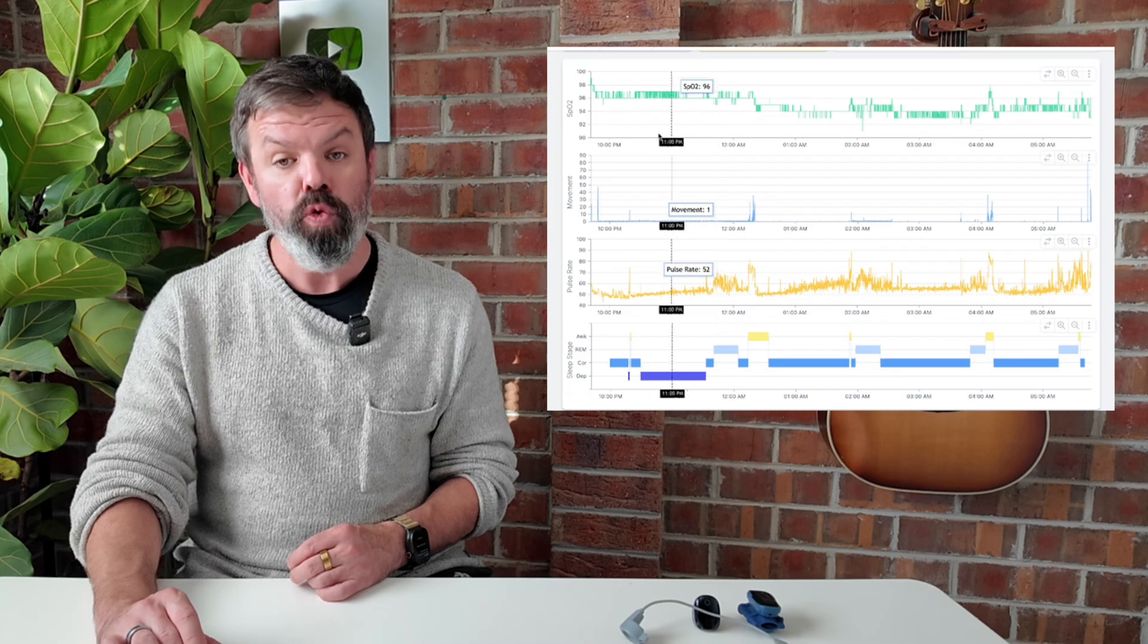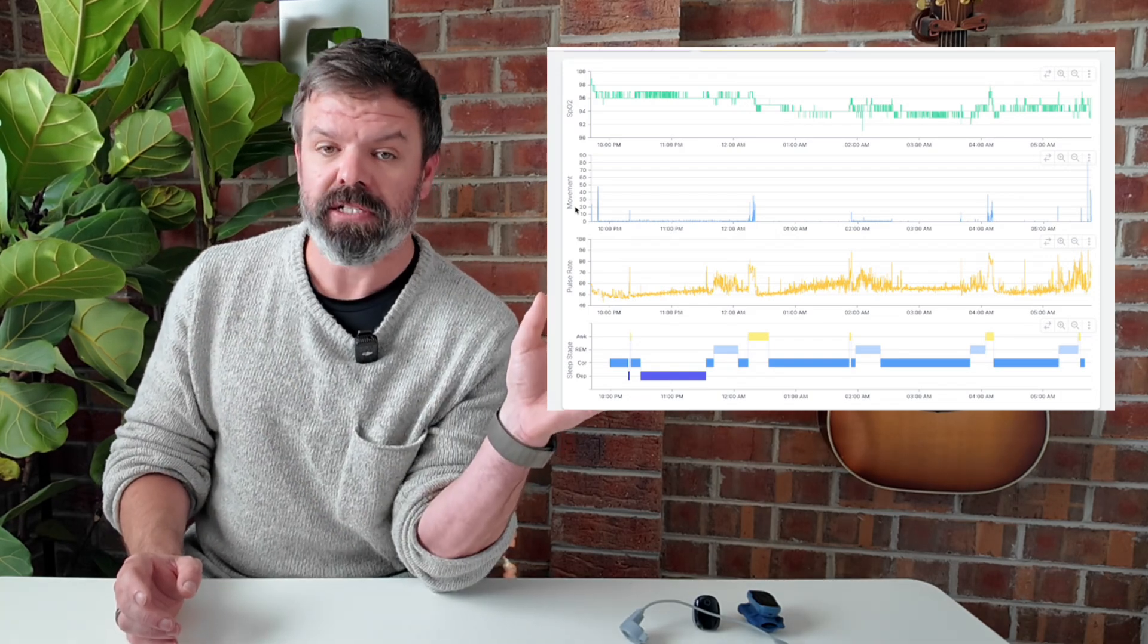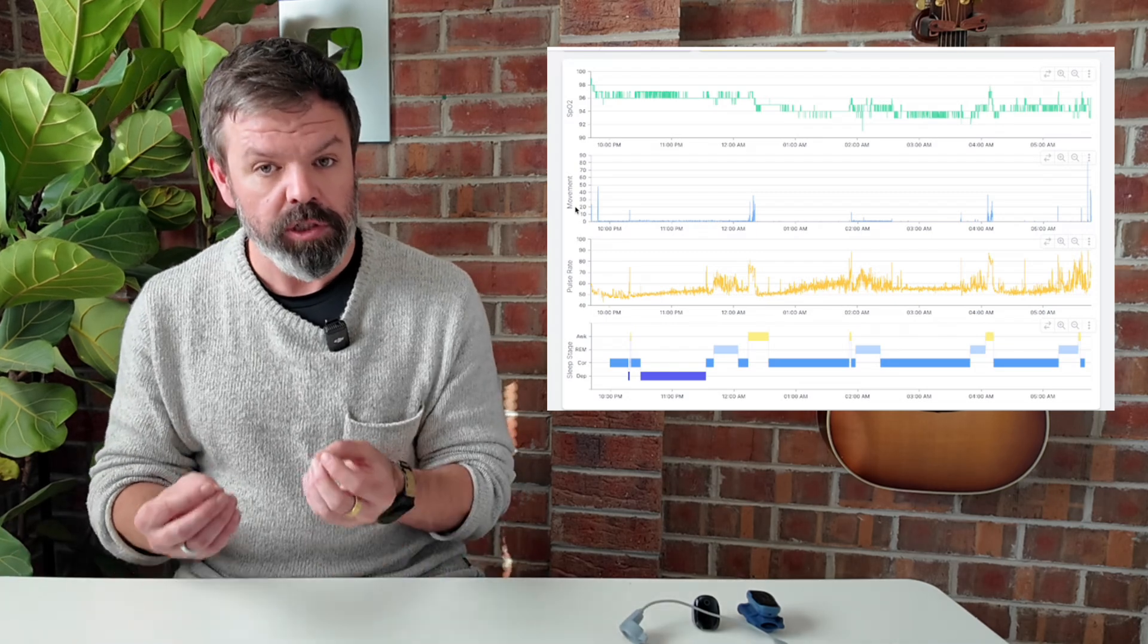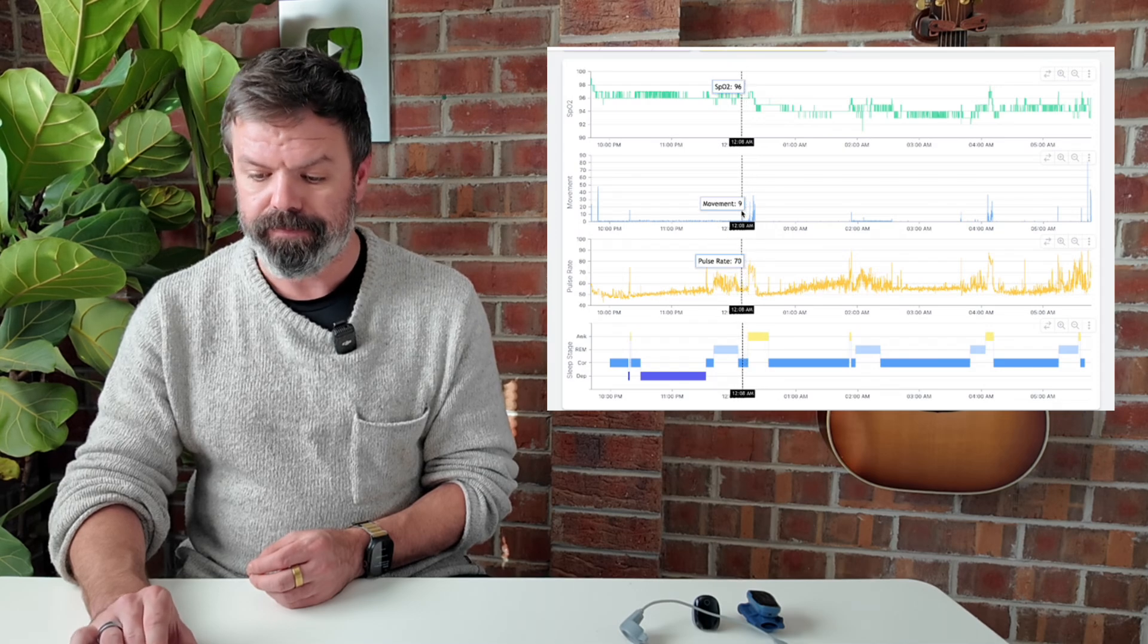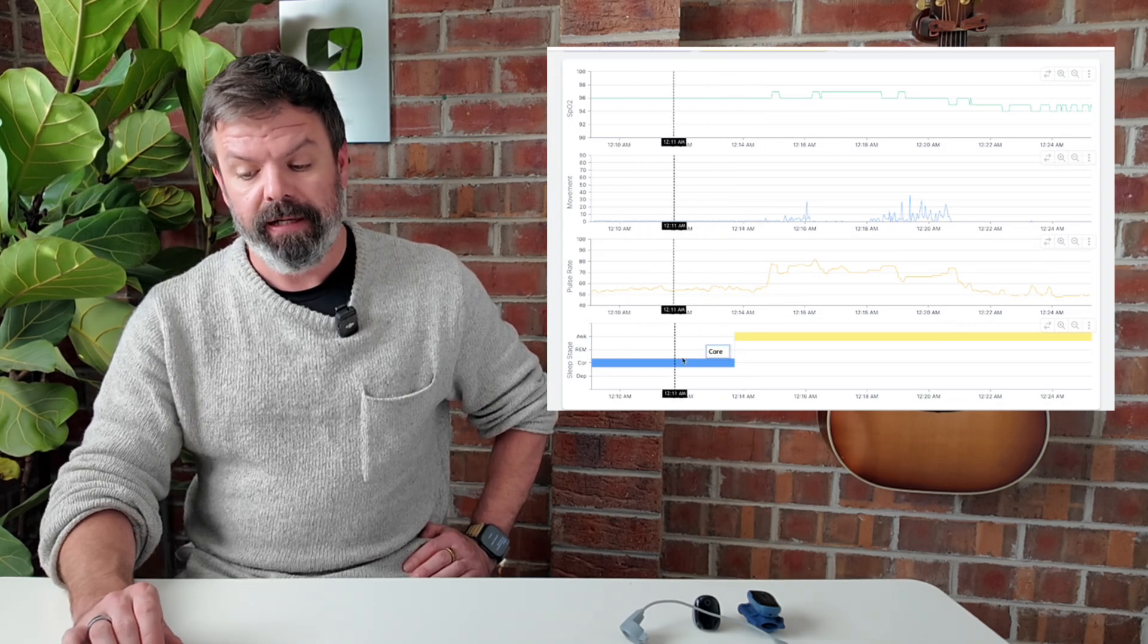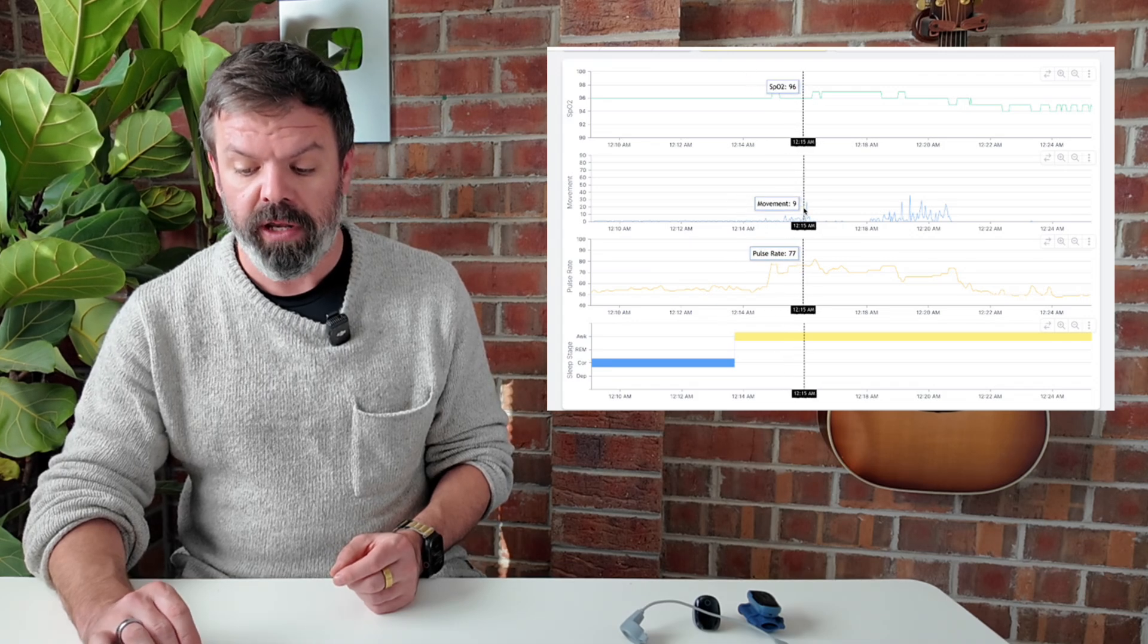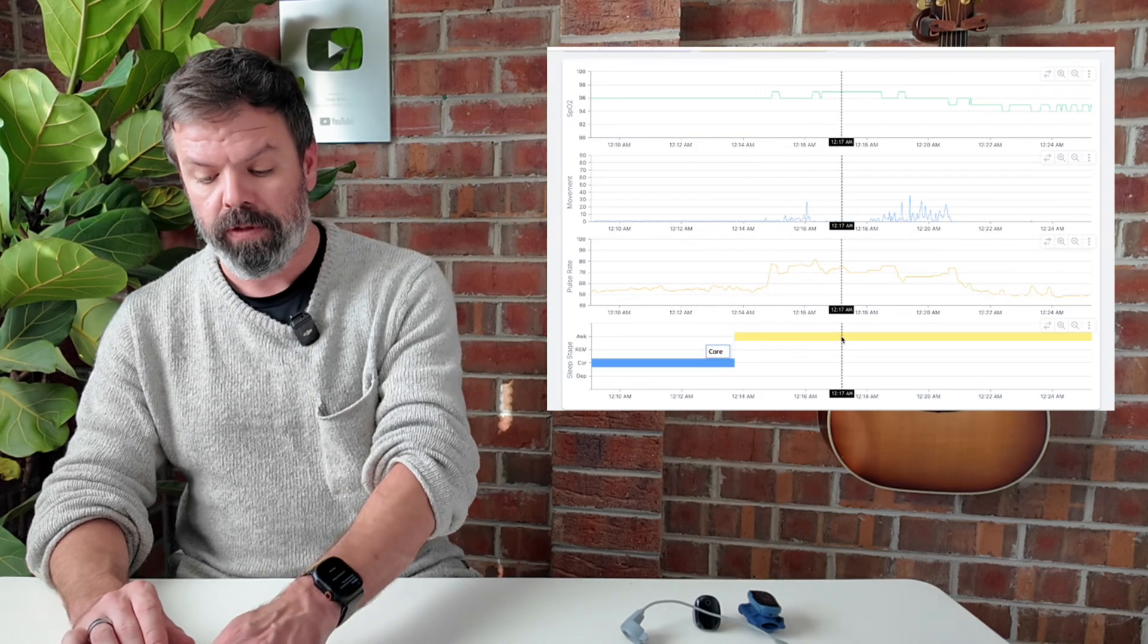We've got our movement trace here. And this is really helpful looking at sleep disturbance. Because a lot of the time, patients have a really good low AHI. But when you have a look at the movement, there's a lot of movement, there's still a lot of respiratory disturbance. So I'll just zoom in here and we'll take a look at that. So I'm just clicking and dragging. This is perfect. So you can see he was in core sleep, this blue section here. And then he's woken up for whatever reason, maybe he needed to go to the loo, whatever it is. He's woken up, we get these movement spikes, we get an increase in the pulse rate. And we can also see here, he is now awake, gone from core to wake.